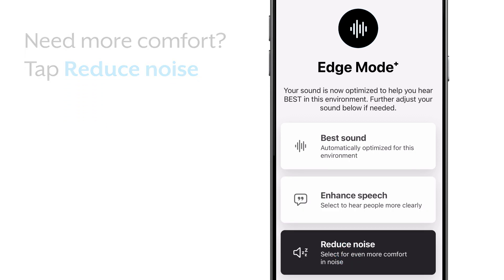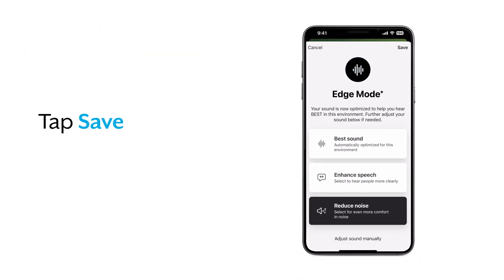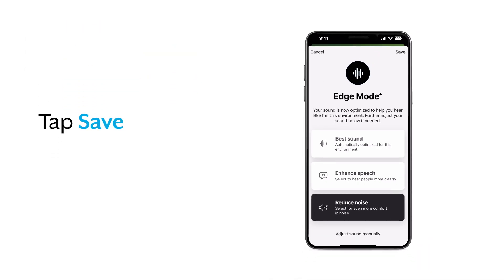Again, you'll hear the difference instantly when you find the best option for your listening environment. Tap save.